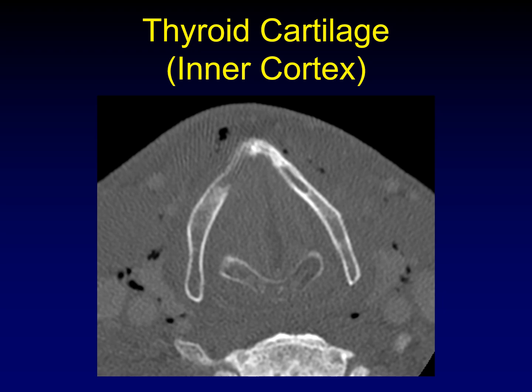When evaluating the thyroid cartilage for erosions, it's very important to distinguish whether only the inner cortex is eroded, or whether both the inner and outer cortices are eroded and tumor has spread outside the cartilaginous boundaries of the larynx — it makes a big difference for staging. Here's an example where the outer cortex is intact but the inner cortex has been eroded by tumor. You can even see a little bit of sclerosis adjacent to the area of erosion.